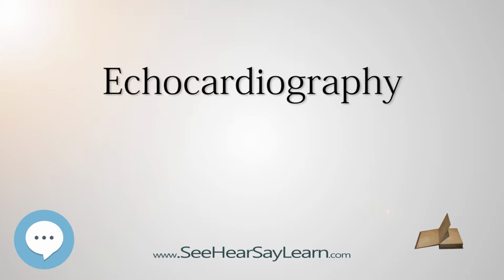Transesophageal echocardiogram. This is an alternative way to perform an echocardiogram. A specialized probe containing an ultrasound transducer at its tip is passed into the patient's esophagus. This allows image and Doppler evaluation from a location directly behind the heart. This is known as a transesophageal echocardiogram.